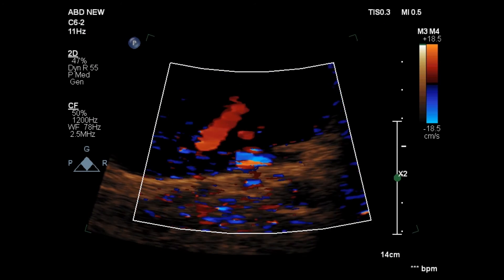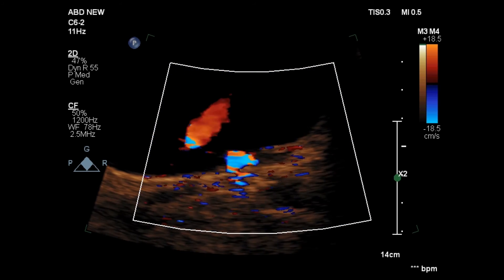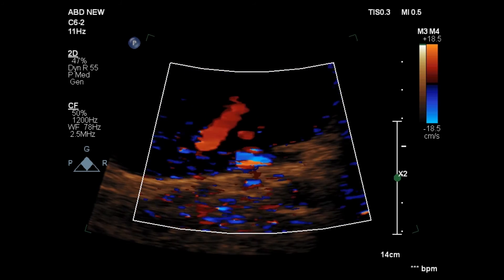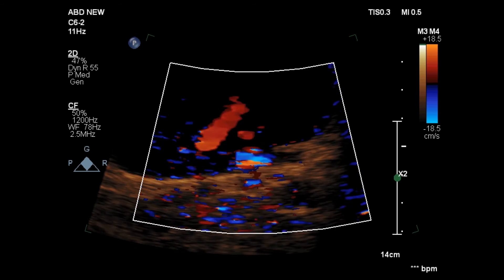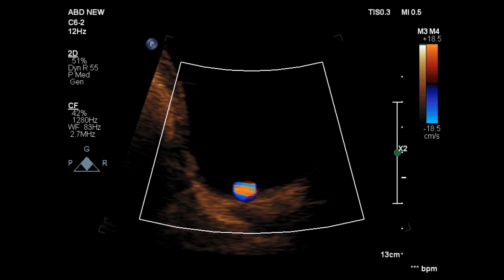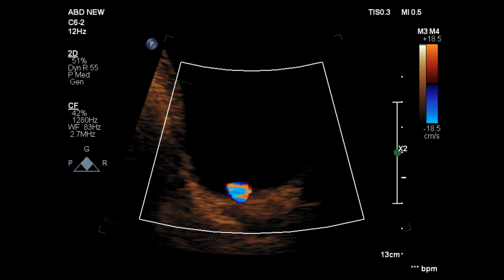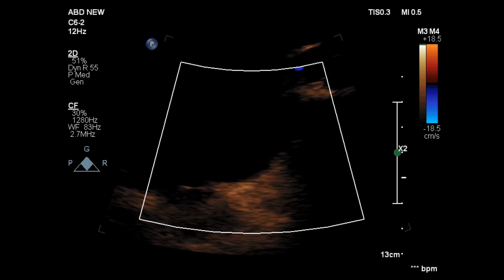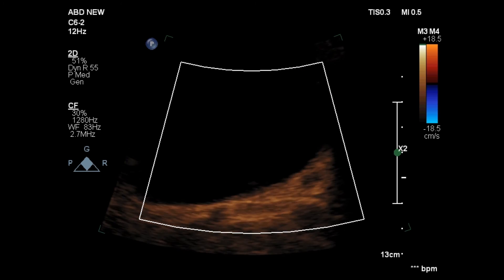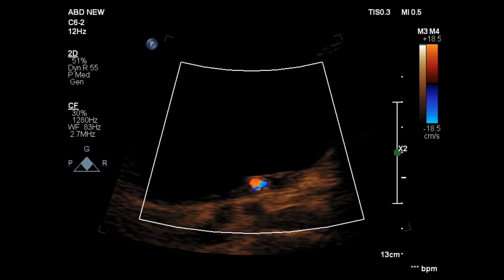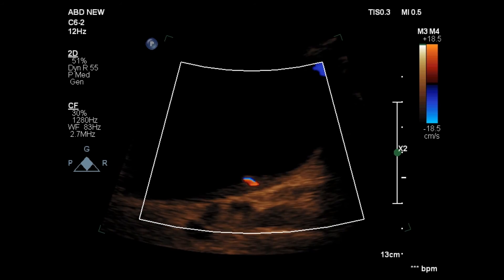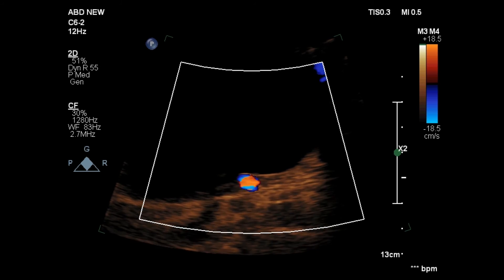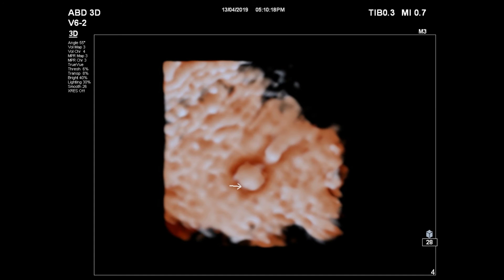Now see this in real time. For more confirmation, 3D ultrasound can be used.